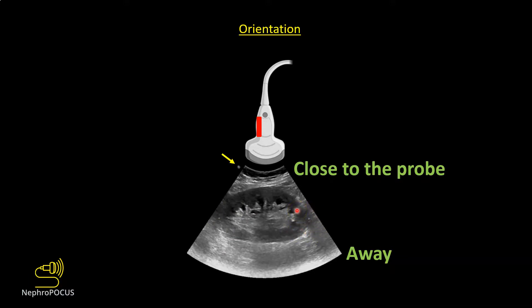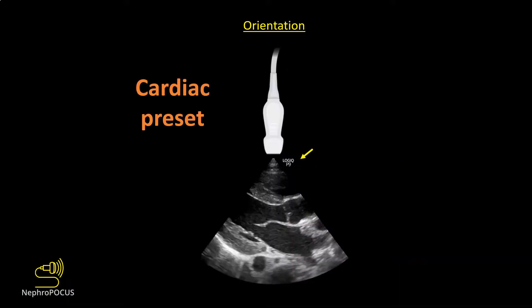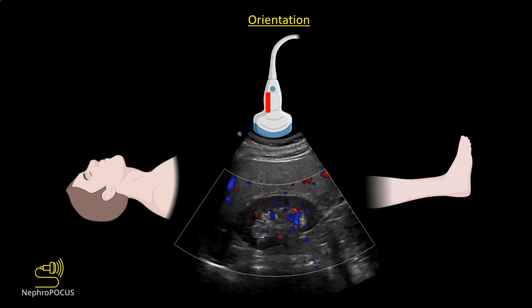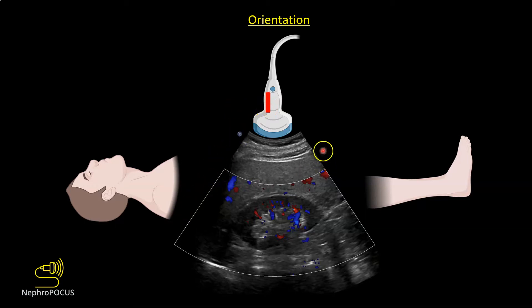One important caution: when using the cardiac preset with a phased array probe, the orientation marker on the screen flips to the right side of the image. Everything else remains the same — the screen indicator still corresponds to the probe orientation marker, structures closer to the probe are on top, and structures farther away are at the bottom. For example, when viewing the right kidney, the liver appears at the top of the image with the kidney below it, and the orientation marker toward the patient's head makes the left side of the screen superior.